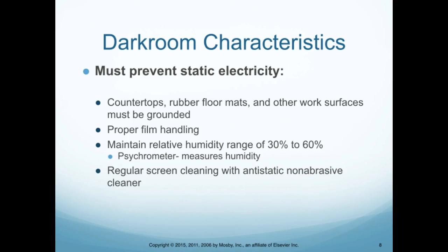And the psychrometer would measure the humidity. Regular film screen cleaning with an anti-static non-abrasive cleaner would really help to reduce the static electricity for the films there.